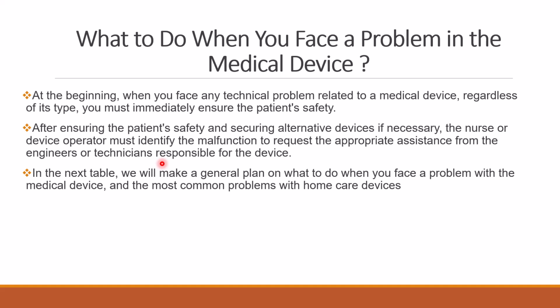In the next table, we are going to talk about the most common errors and problems in the medical devices used in home care, and we are going to give you a general guideline on how to deal with them.